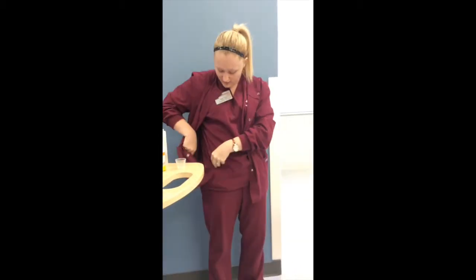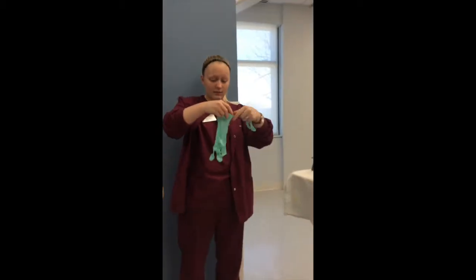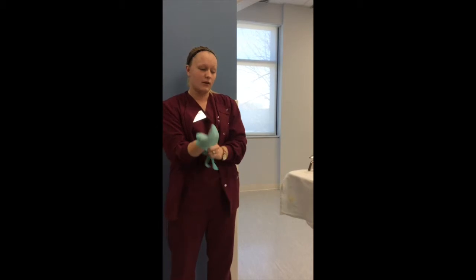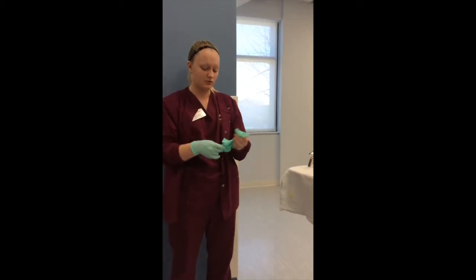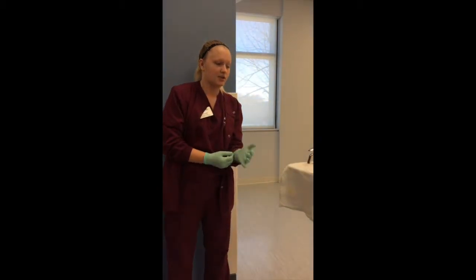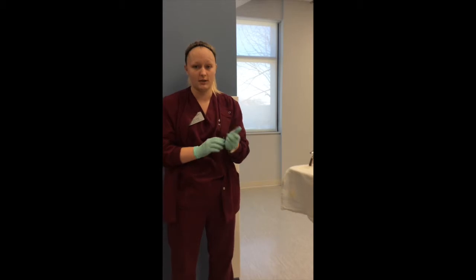So I'm going to perform hand hygiene and get my gloves on. Since they were on a feeding tube, they should still be in high Fowler's position. If they are on suction, I should make sure they're in high Fowler's position as well before I give this medication. With suction, I would just stop the suction and give the medication, and then I'll leave the suction off for 30 minutes.